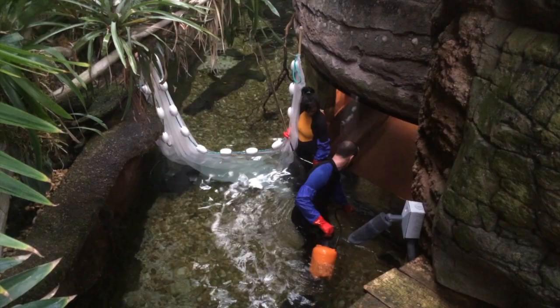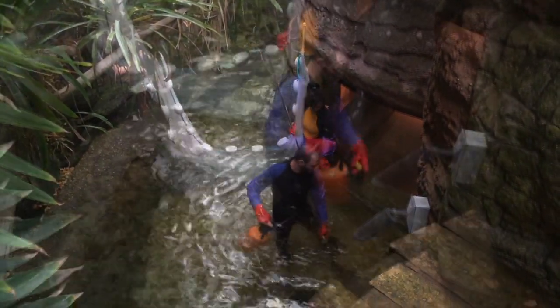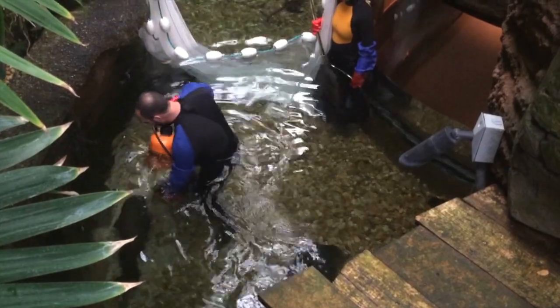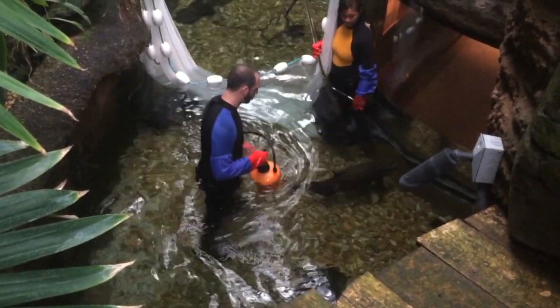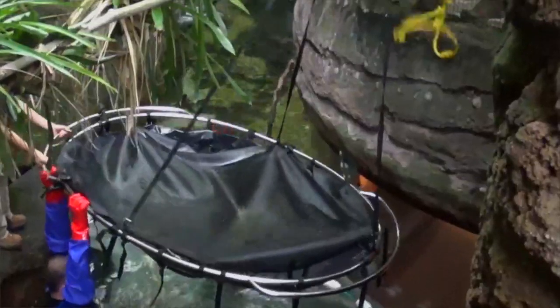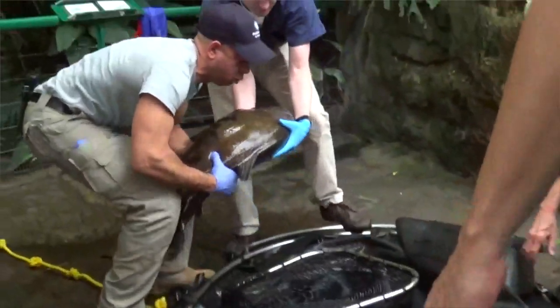There are several things that you have to logistically plan for when you're trying to perform a biopsy on a fish. We had to anesthetize the fish essentially in the tank first. We used a garden pump sprayer to spray anesthetic into the mouth and around the gills of the fish. This method allows us to do a controlled anesthetic delivery to one fish and not to all the fish. From there we placed it into a large net, hoisted it up over the bridge, and placed it on our surgical table to perform the procedure.